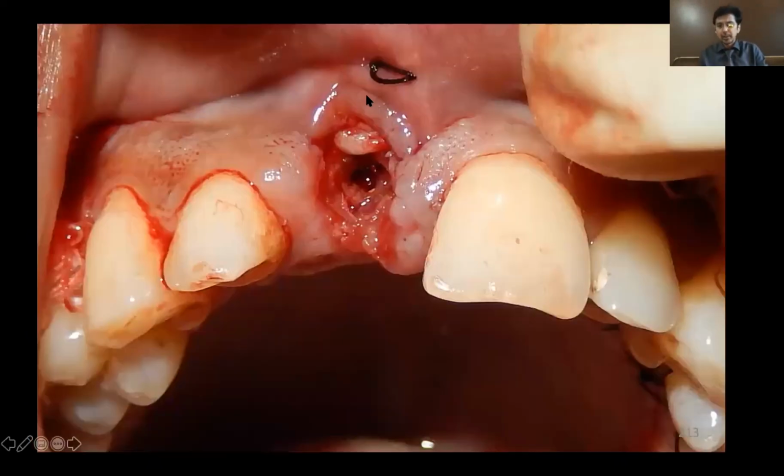With one suture, this direct loop suture, you tend to pull the connective tissue inside, meaning you engage the epithelium of that pouch which you had created, you take it out, you engage the connective tissue and you take it back into the pouch, and you tie a knot here. So that suture will pull the connective tissue underneath this pouch which you have created.